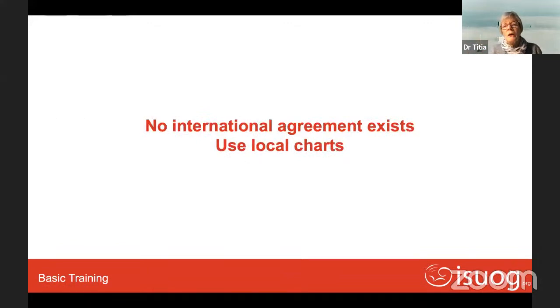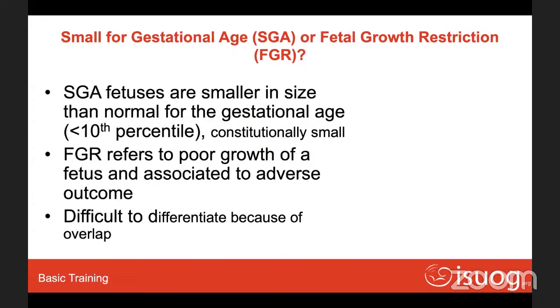So, what I tried to tell you already, there's no international agreement on which graphs to use, but use the local chart or be sure that in your country or in your referral area, everybody is using the same chart, but use the Hadlock formula to estimate the fetal weight.